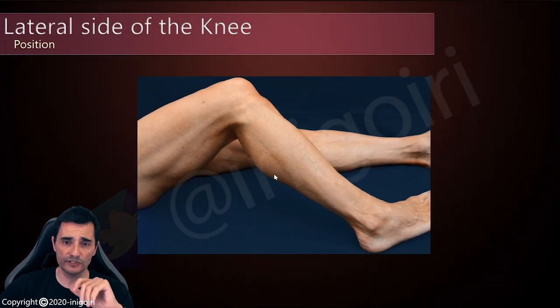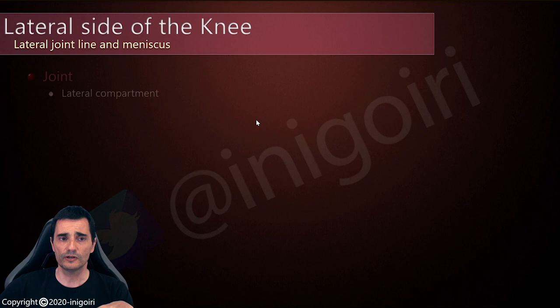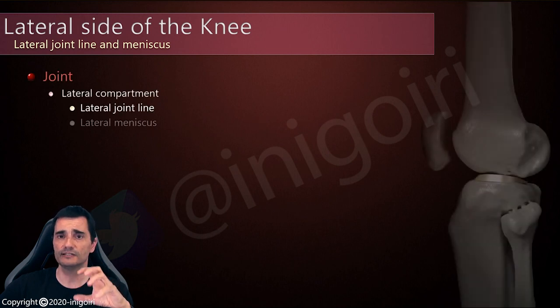To check this area, I usually ask the patient to rotate internally the tibia, the leg, and to place the foot in an adducted position. With this position I have good access to the lateral structures and it is very easy to perform. We are going to check the lateral compartment, first of all the joint line and the lateral meniscus.